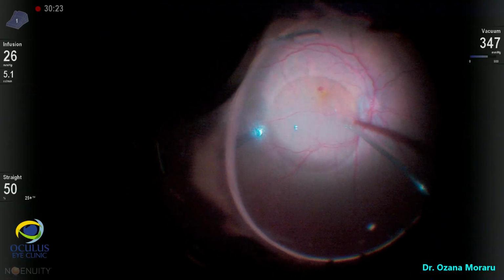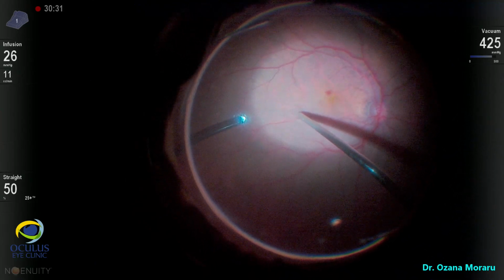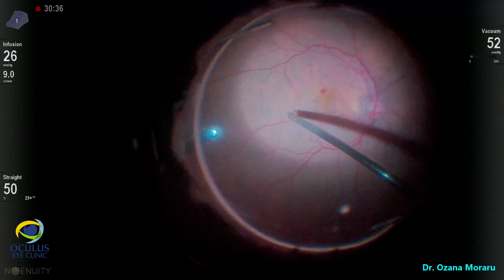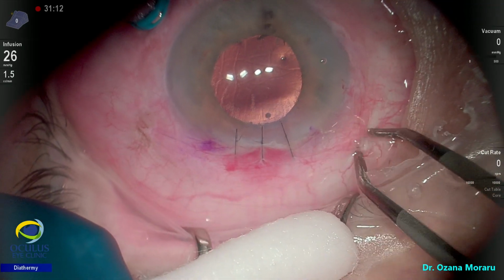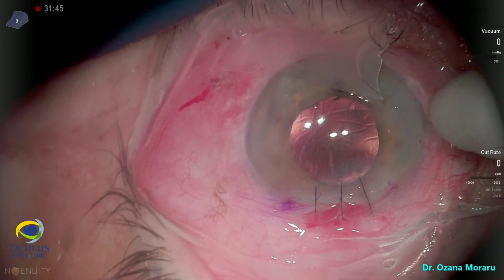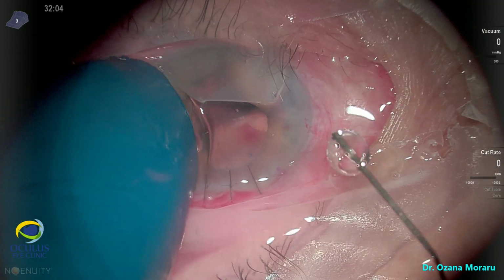We implanted it unfolded, we checked that everything is okay, and then we pushed the optic a bit to obtain the optic capture. And now we came back to the posterior pole to aspirate the PFCL. We sutured the limbal incision with 10-0 nylon suture. We removed the trocars, and now checking the IOP, we saw that it's a bit soft, so we filled the eye with more BSS via paracentesis, and we left the eye with BSS. And that was the surgery.